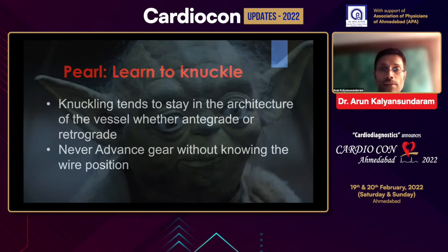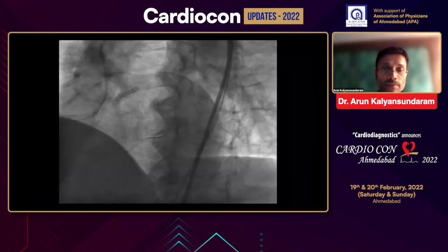One of the key tips that I want to emphasize, especially in India, is that knuckles tend to stay in the architecture of the vessel, whether it's antegrade or retrograde, as you saw in the last couple of cases. Do not advance gear without knowing your wire position. That's a very important thing.